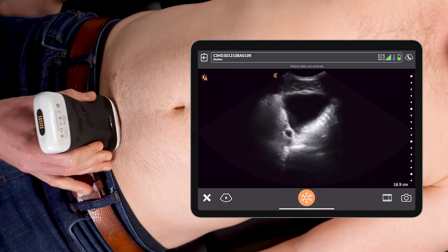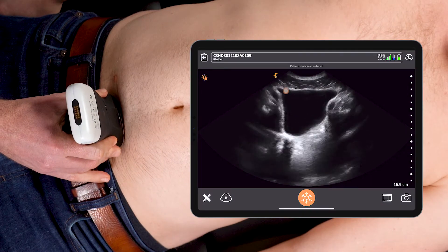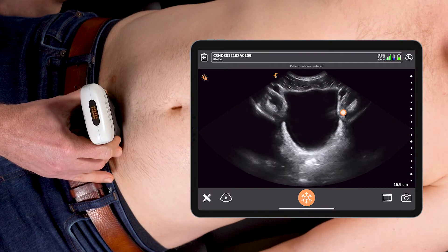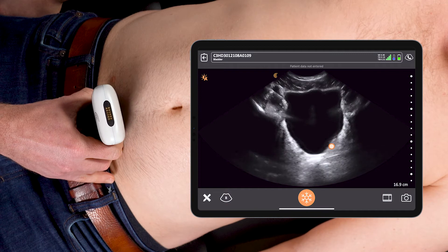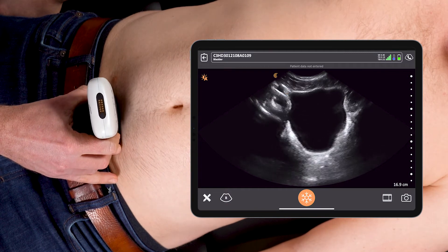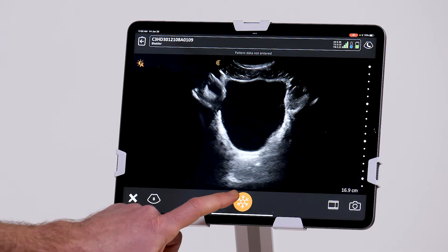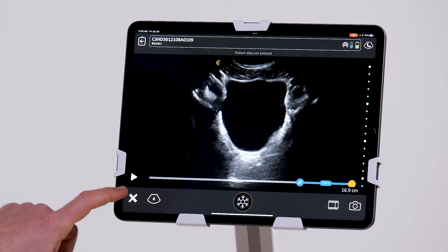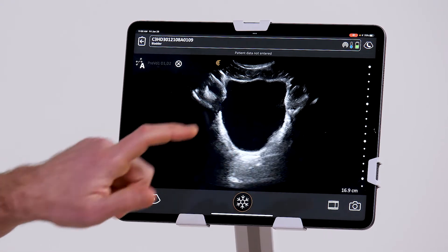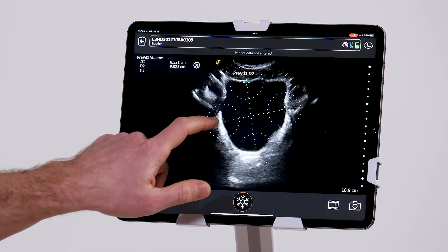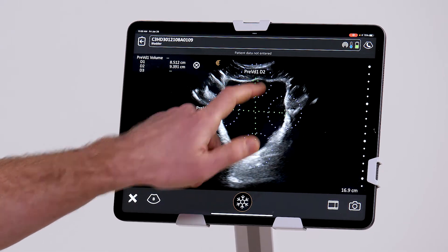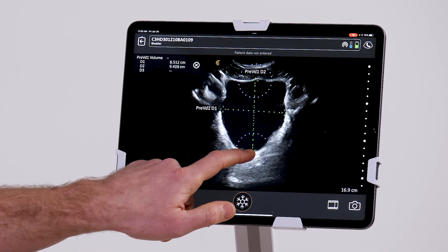I start in the transverse orientation, aiming deep into the pelvis to identify the fluid-filled structure of the bladder, and I'll fan to maximize its diameter. At that point I'll freeze the screen, and when I go into my calculations, I can quickly estimate the pre-void by just tapping on the bladder, and I can modify them to make sure I really like where they set up.